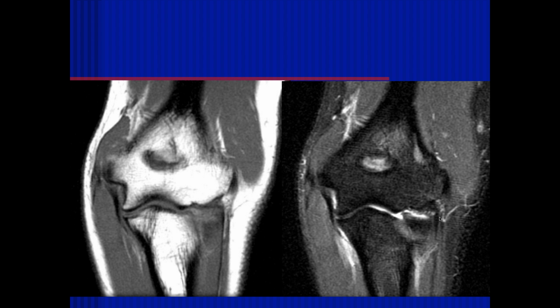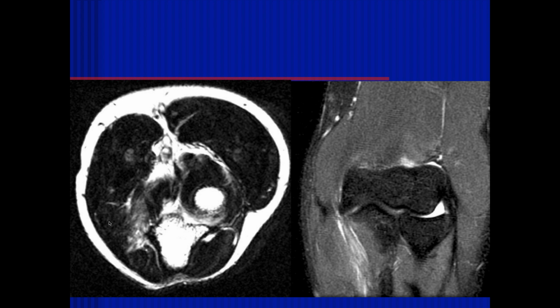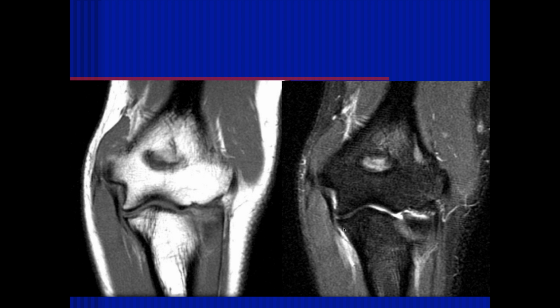Here there's some mild increased signal within the ulnar collateral ligament at the attachment to the medial epicondyle, but I don't see a tear. There's some mild increased signal within the distal muscle. This is another muscle strain. I'm not sure if this is the flexor carpi ulnaris or which muscle. We don't see the distal ulnar collateral ligament go all the way to the bone, so this is a tear of the distal attachment.